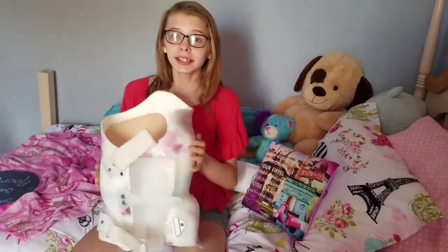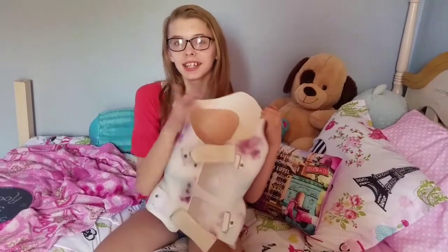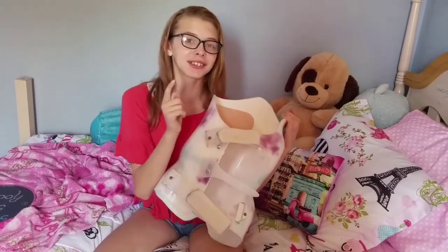Hello my beautiful brace faces! Today I'm going to be showing you how to clean your brace, some hacks about cleaning your brace, and what you need. Stay until the end of this video to see a really special announcement I have for you guys.